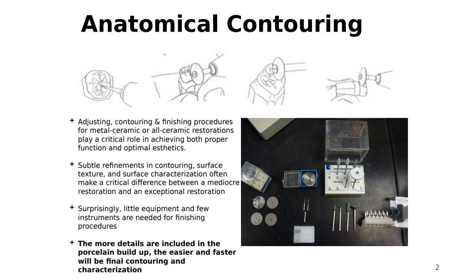Anatomical contour relates to the shape of the teeth that we learn in general, right? So we learn how many cusps, for instance, the upper first premolar has. What about how many cusps the first lower molar has?